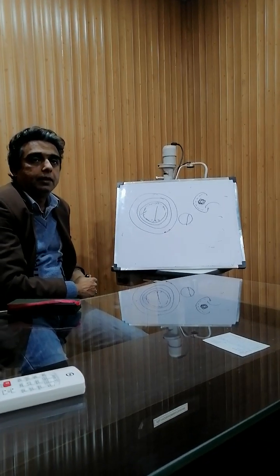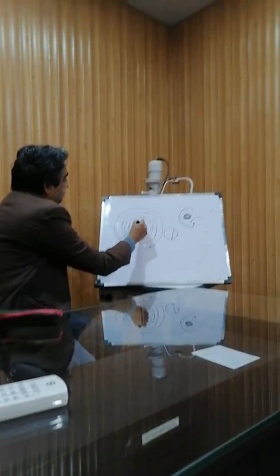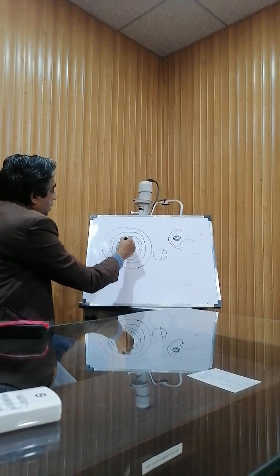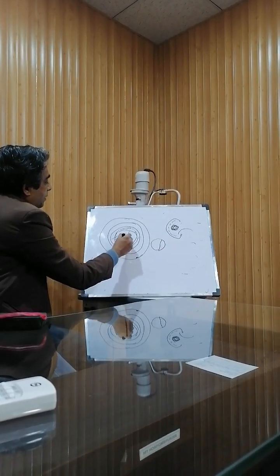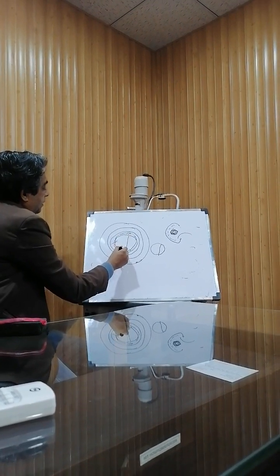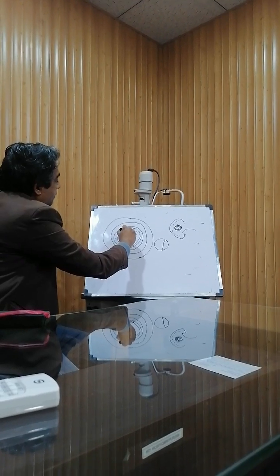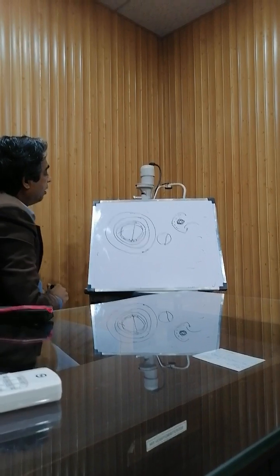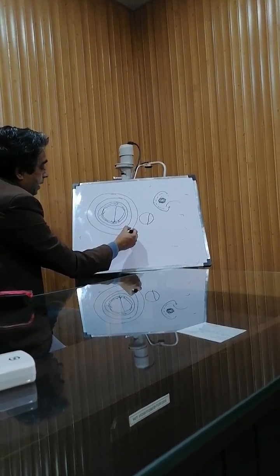Are you getting my point? Yes, sir. It will open up inside the eye, and so here we have the whole lens. There will be no demarcation line; this is just for your understanding. And the same haptic, and this is the optic. Now you can see that through just 3.2 millimeter we have inserted 5.5 millimeter of lens, and there is no need of applying any suture.